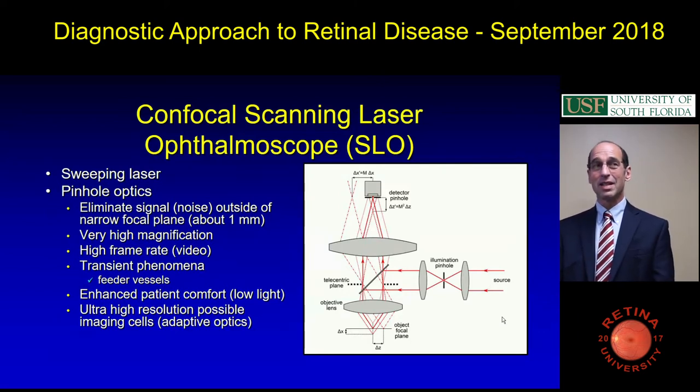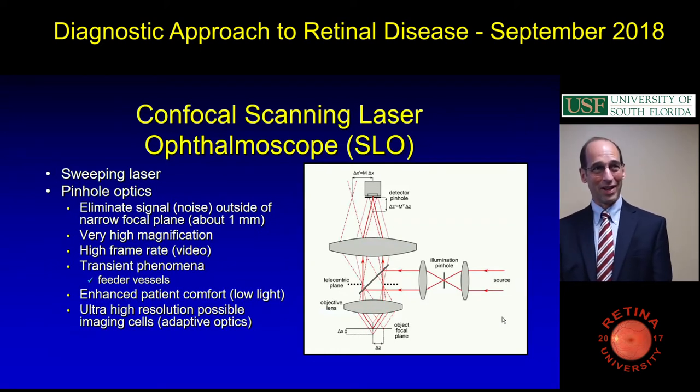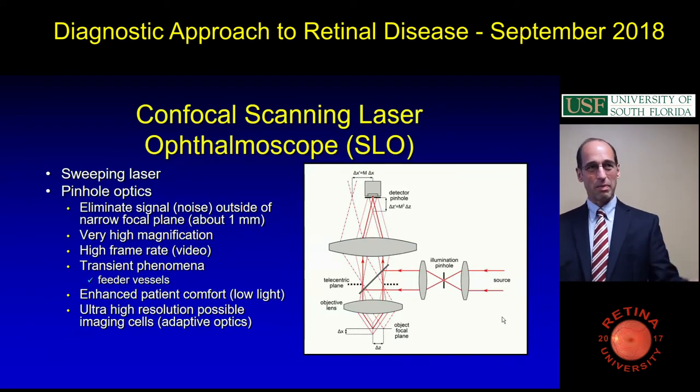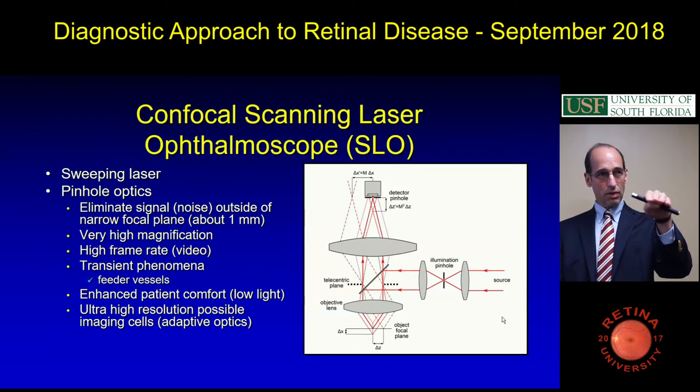The bump. Yeah. That's good to do, because if you're going to cryo retinal tears later, you hate to lose the cryo and realize you were on the edge of the macula. When you're depressed. When you're cryoing. I've seen all these things. Someone will be cryoing and they're like, oh my gosh, so you've got to back up. When you're depressing, do you scoot a couple of millimeters to the side before you pull out? Yeah, you kind of go back and forth a little bit.